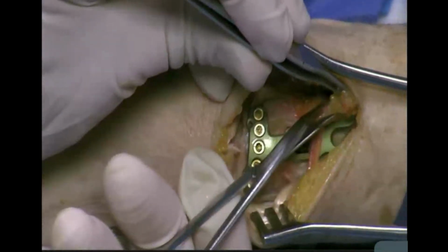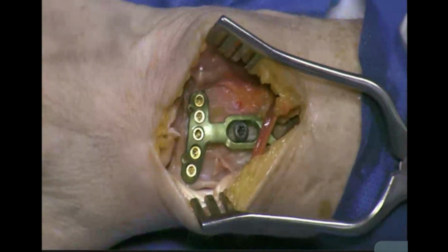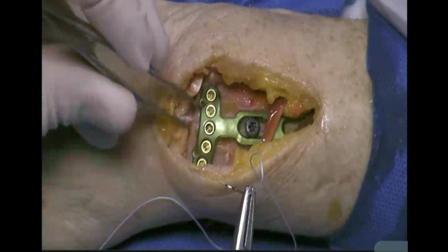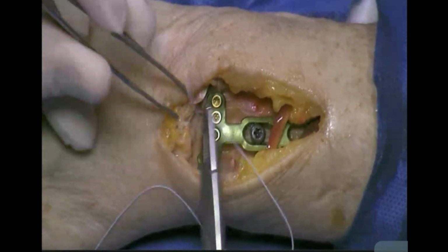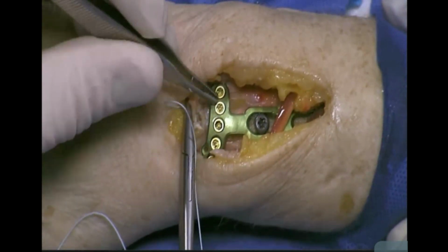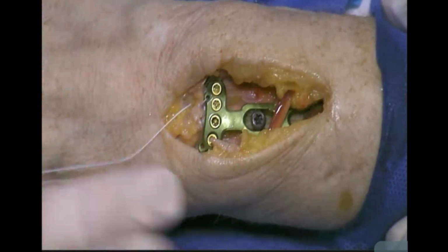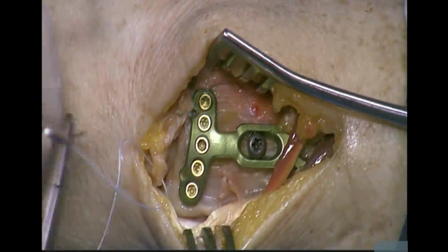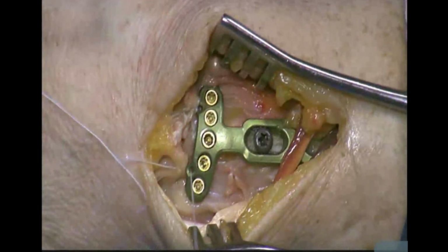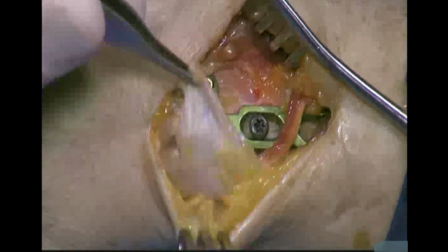I'm going to take a little bit of tension off of this EPL, just mobilize it just a touch, release some of the fascia. So first is our capsular repair. Sometimes we can leave a cuff of tissue here, and if we haven't been able to do that, this plate provides two areas to fix the capsule back to the dorsal lip of the radius. One more again, I did not save much tissue there, so the plate is going to bail us out. And then we'll lay the retinaculum over.